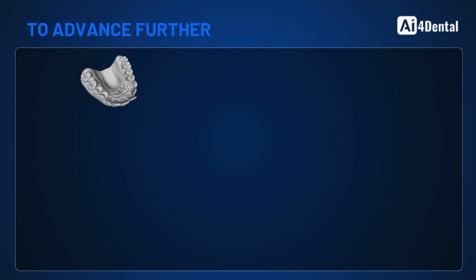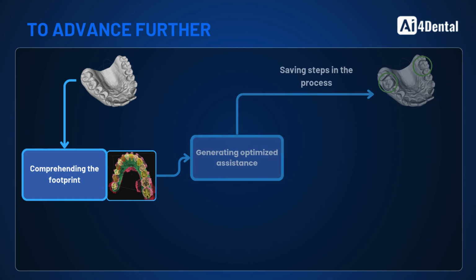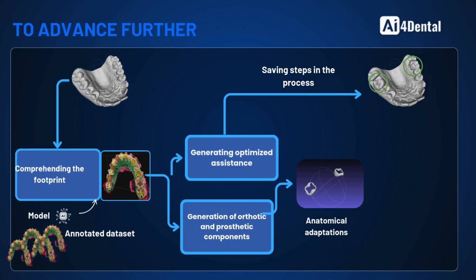It follows the same principles as zone detection, but identifies various types of areas, enabling more specific applications. For instance, one might identify a specific tooth type to create custom bands or orthodontic models. The segmentation process involves feeding annotated scans into the AI, allowing it to learn how to identify and categorize different dental zones. This data is then aggregated into an AI model capable of handling new cases.